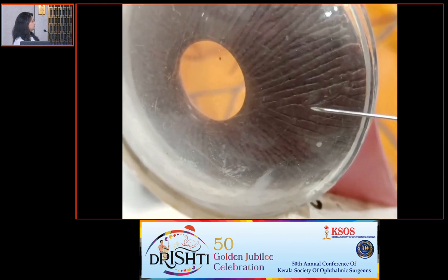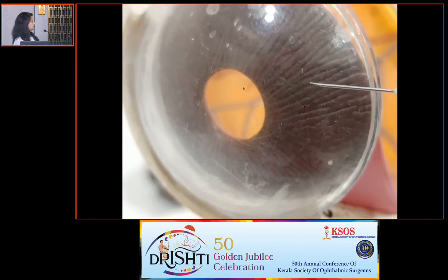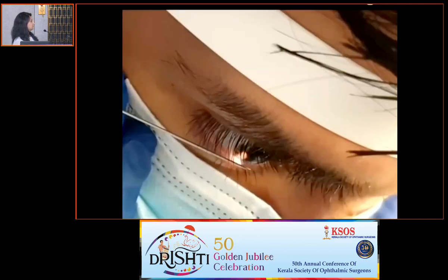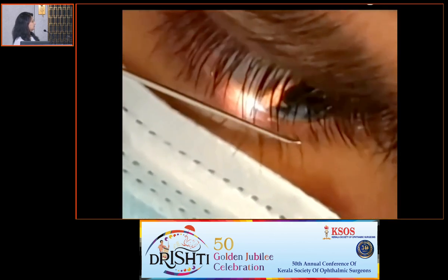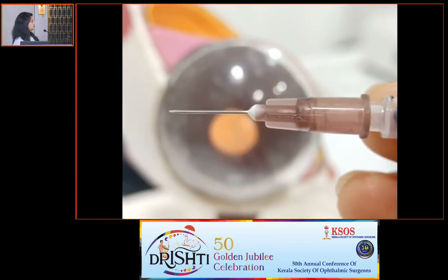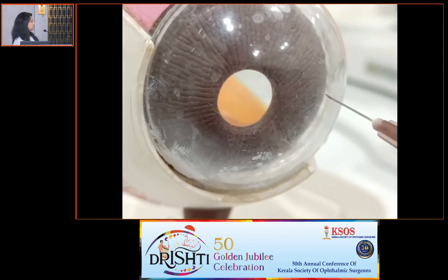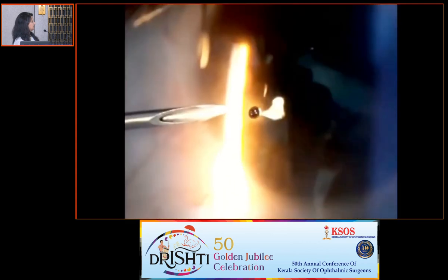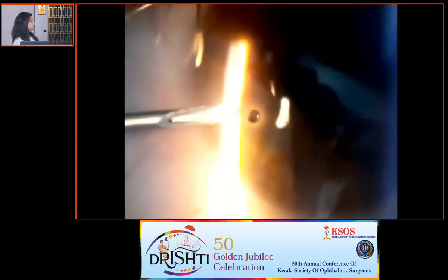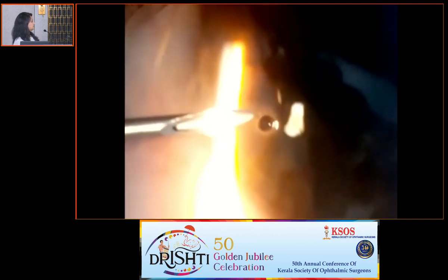When we approach the cornea from the temporal aspect, if the needle is bent, we are placing the bevel up on the cornea. Hence, even if the patient moves, the chance of corneal perforation is minimal. Whereas if we keep the needle straight, it is directed towards the anterior chamber, and if there is slight movement, the cornea can get perforated. So once the needle is bent, we ask the patient to look straight and approach from the temporal aspect. With the bevel up, we go towards the anterior stroma and disturb the foreign body.